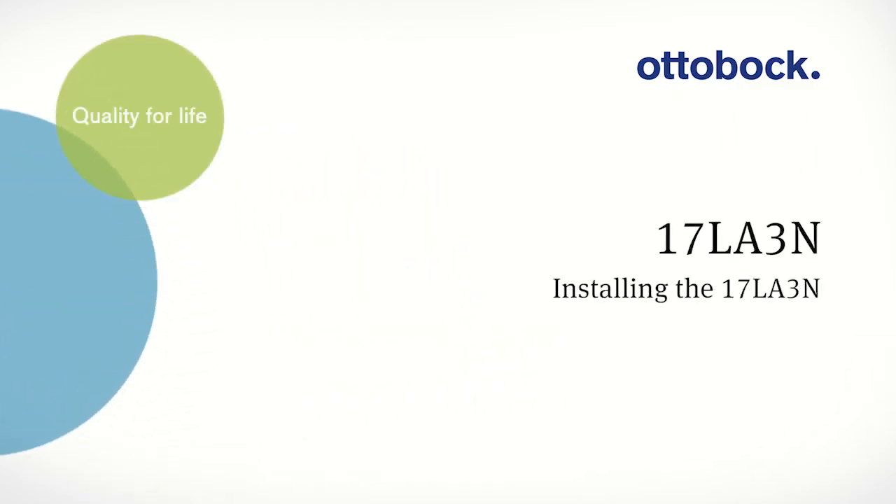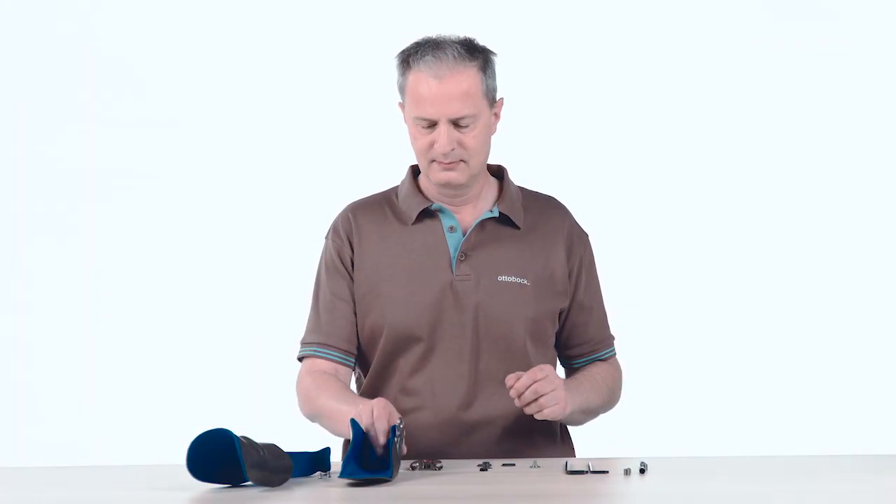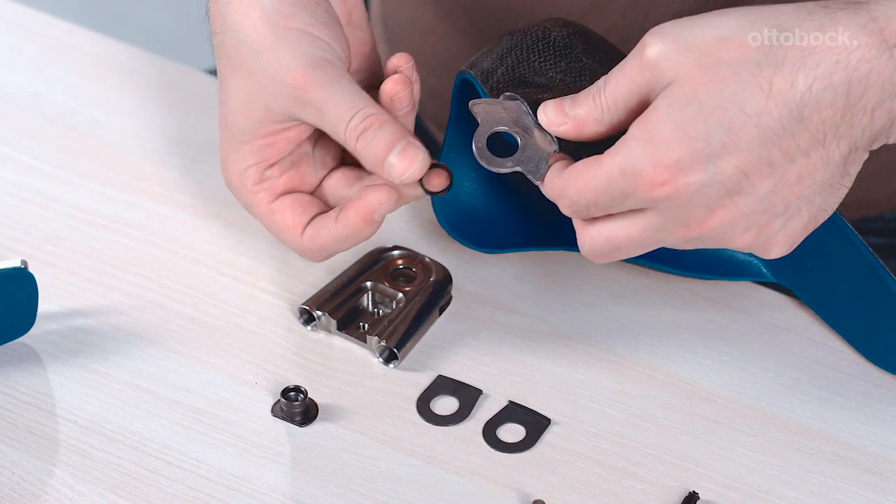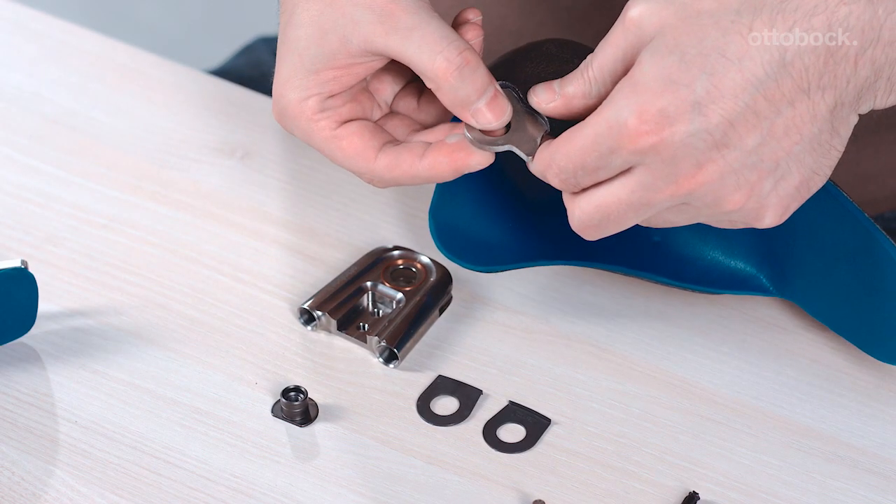Installing the 17LA3N. Before the unilateral ankle joint can be adjusted to the needs of the user, the joint must be installed for the initial fitting.